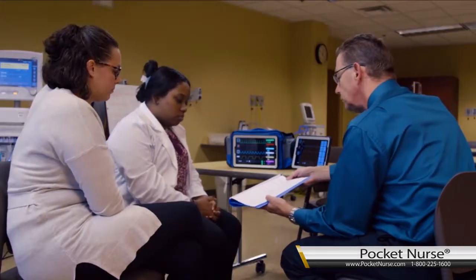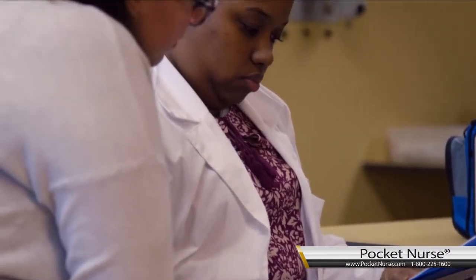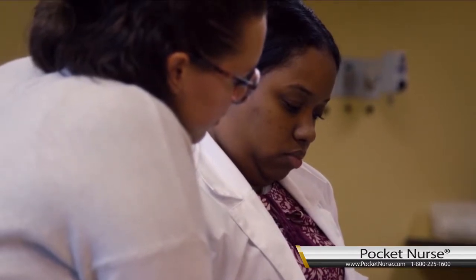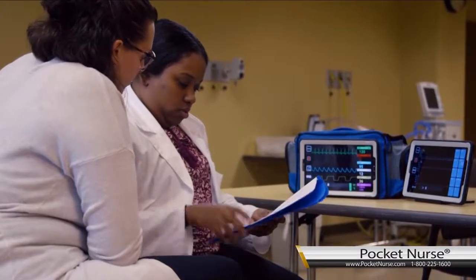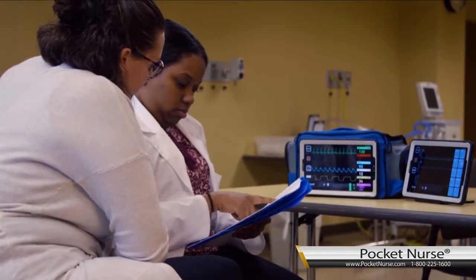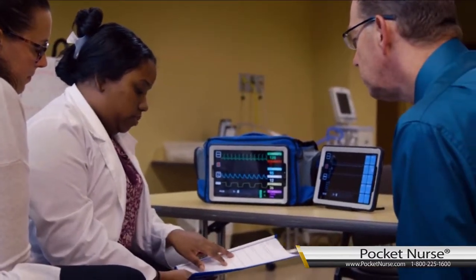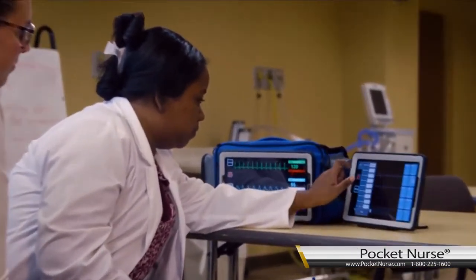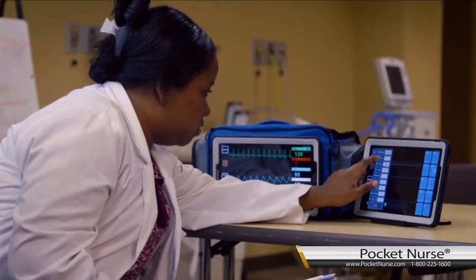I'm just going to give you guys this. Understanding that this patient's intubated and he's head trauma, which of the following choices would be the best choice? And then once you guys have made your choice, I'm actually going to have you input the ventilator settings on the ventilator screen. What choice? Choice C. Volume control. Okay, so let's go ahead and put those in on the screen.